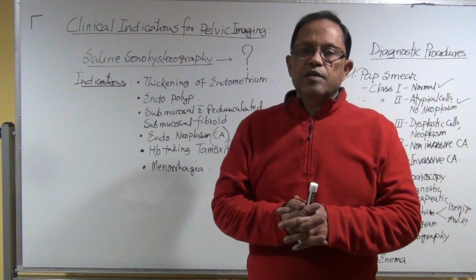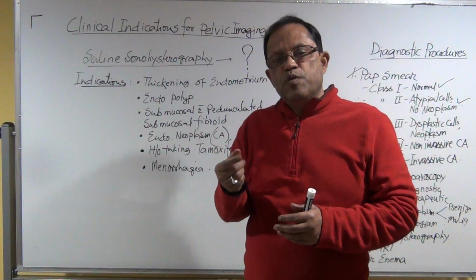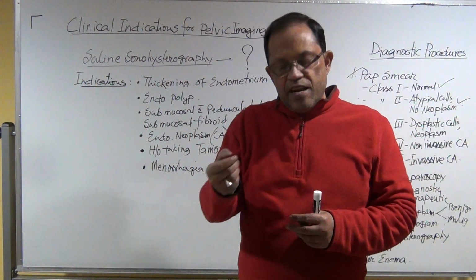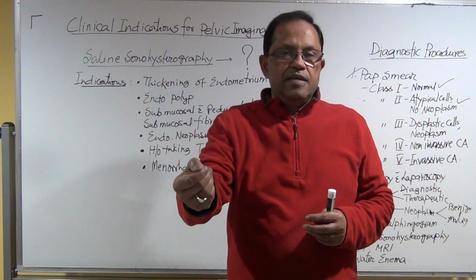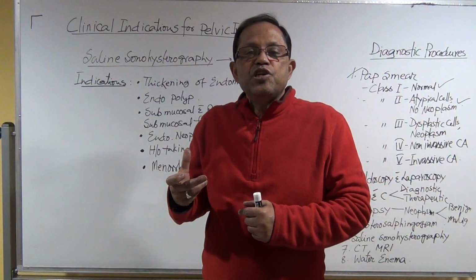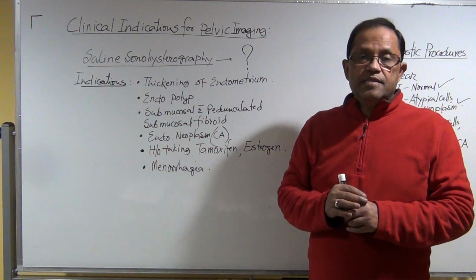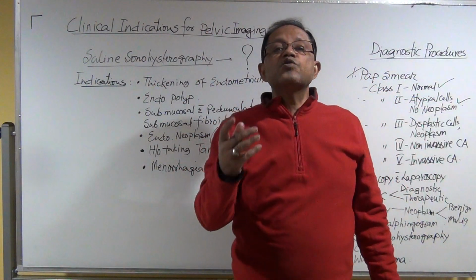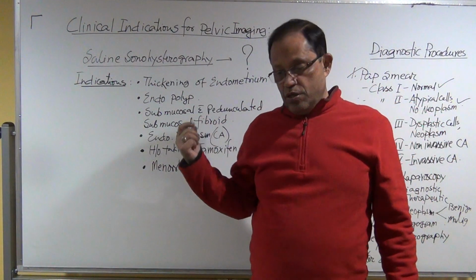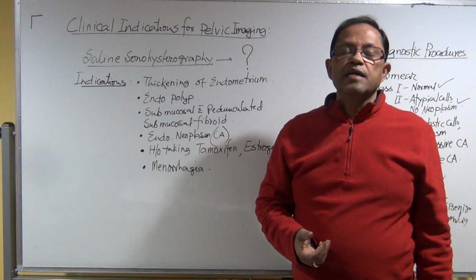The doctor will be there, who will actually insert the catheter or the tube or metallic rod first, or plastic tubes through the cervical canal, making it dilated, and finally they insert the catheter that goes inside the uterine cavity, and they inject the 25 cc of water into the uterine cavity.